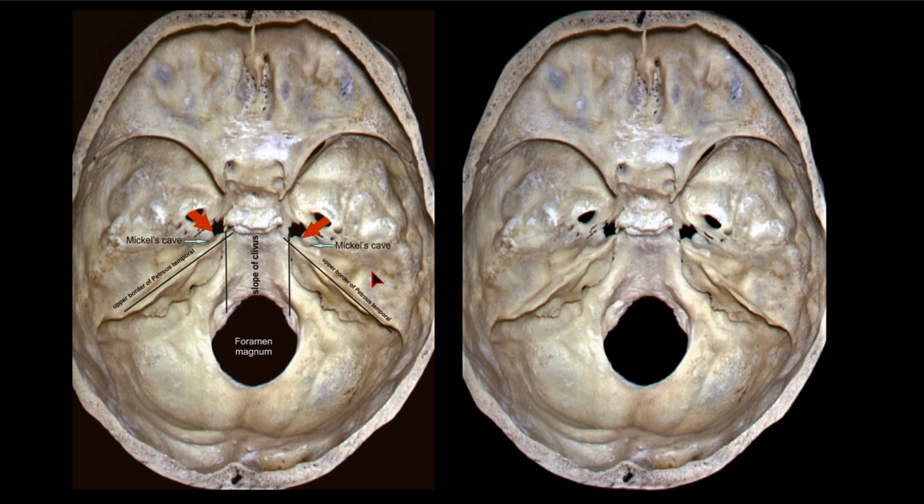Now you will understand what is the fact behind this clivus petrous junction and the needle trajectory. So you see here, this is the petrous, superior border of the petrous. All you have seen is the Meckel's cave. Here the superior border of the petrous. This is the clivus line. So this is the junction between the clivus and petrous, where you will get the Meckel's cave, which is just below the foramen ovale. So that is why when we see in the lateral view, the needle trajectory should be at the junction between the clivus and petrous.